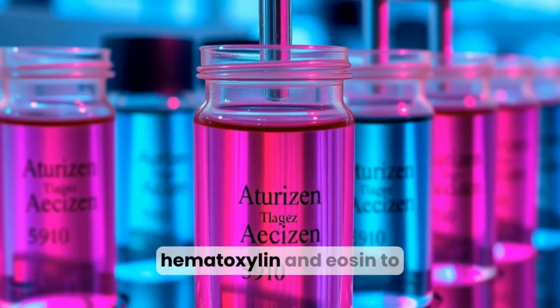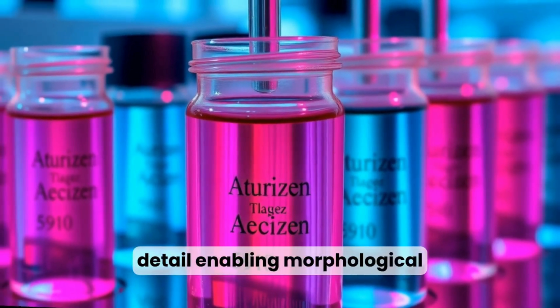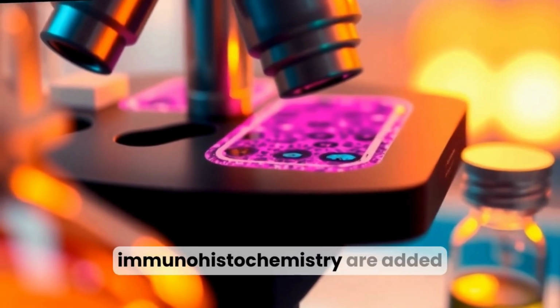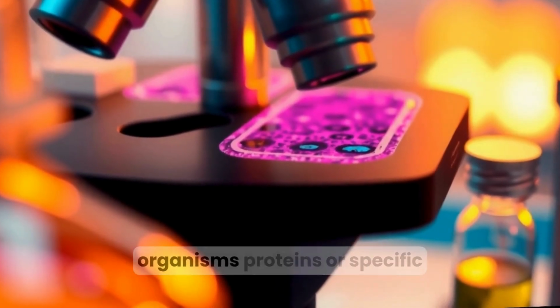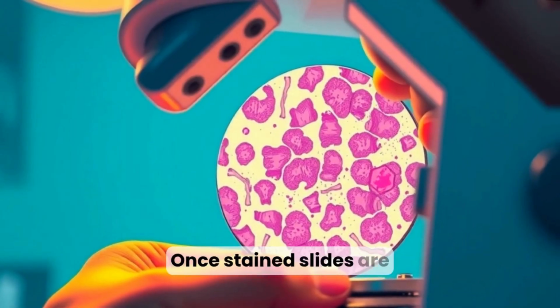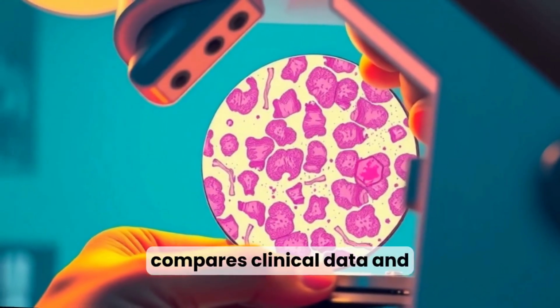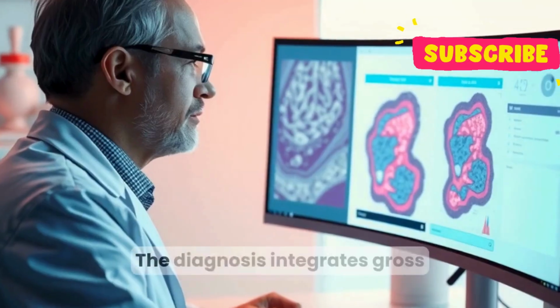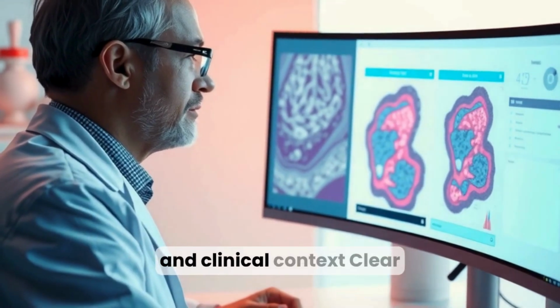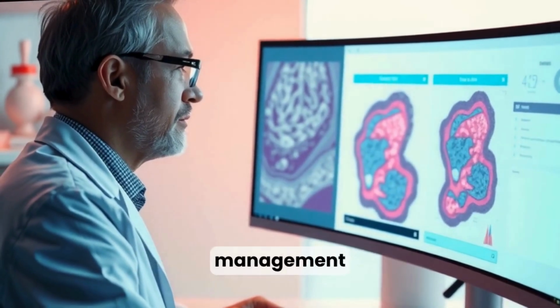Routine staining uses hematoxylin and eosin to reveal nuclear and cytoplasmic detail, enabling morphological assessment under the microscope. Special stains and immunohistochemistry are added when needed to highlight organisms, proteins, or specific diagnostic markers. Once stained, slides are reviewed by the pathologist, who assesses morphology, compares clinical data, and formulates a diagnosis. The diagnosis integrates gross findings, microscopic features, and clinical context. Clear communication with clinicians ensures appropriate patient management.